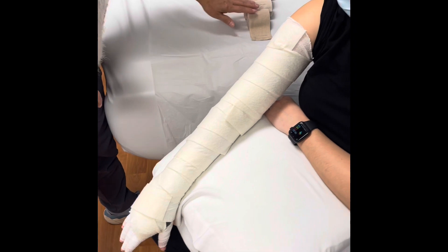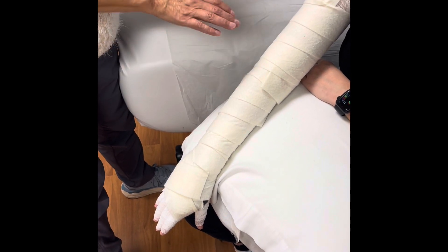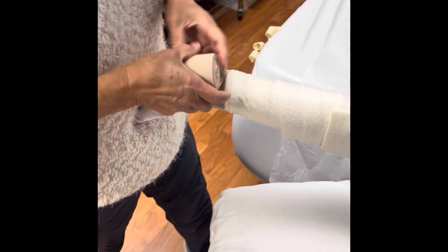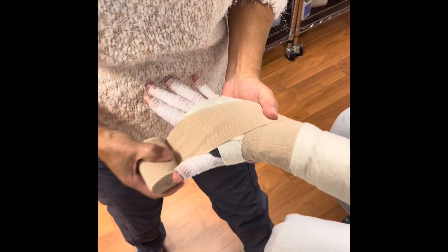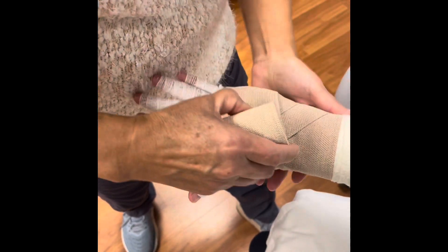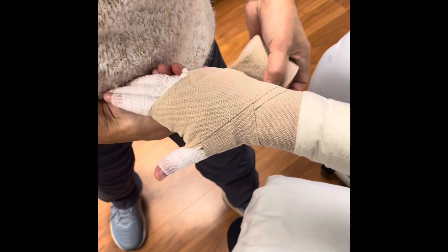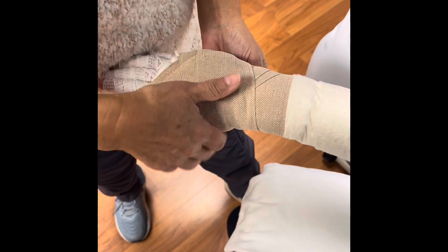The bandages come in different sizes. We use the smallest at the hand, next with the forearm, then the upper arm, and then a larger one to cover the whole thing. We start at the wrist — I tell the patient to make a fist and push it into my belly. We stabilize it at the wrist with some tension, then open the hand as wide as you can, and we come around the thumb two times, then come on up and over once, back around twice at the hand, and then go back around above the thumb.